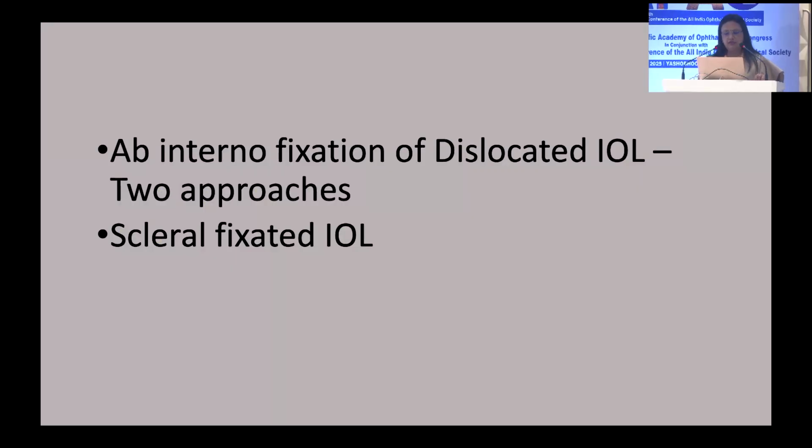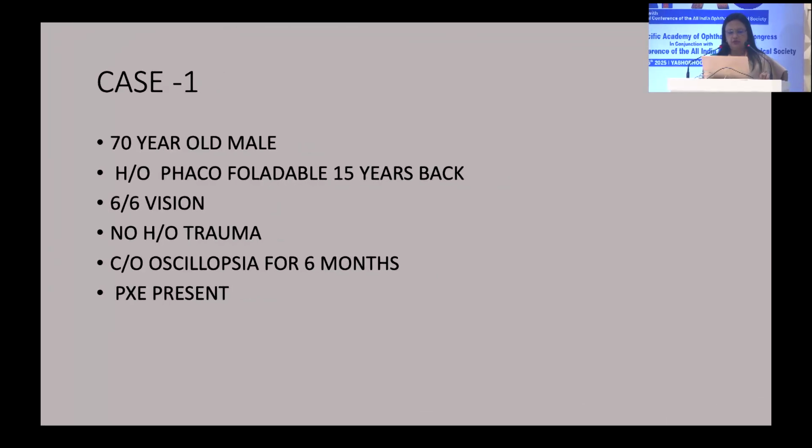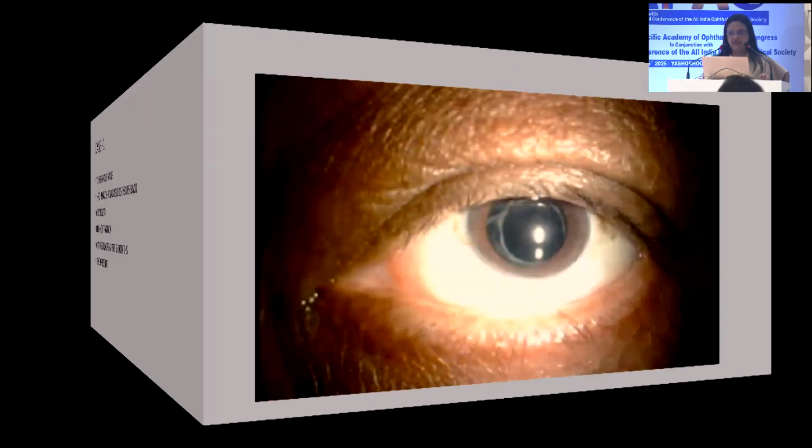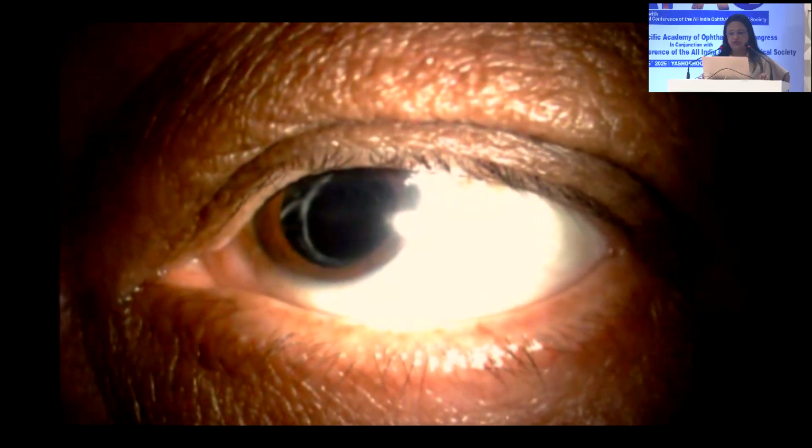I'm just going to show you some case scenarios in which we have fixated wobbly IOLs or dislocated IOLs. Case 1 was a 70-year-old male who had a phaco foldable done 15 years back by us, had excellent vision of 6/6, no history of trauma, but he complained of oscillopsia or some shaking vision. On examination, he had pseudo-exfoliation. You can see the video here showing how the lens is moving.